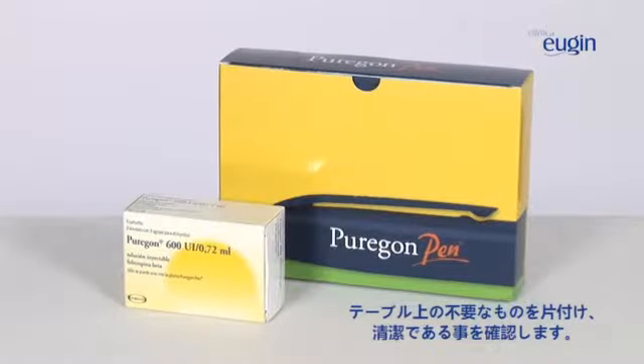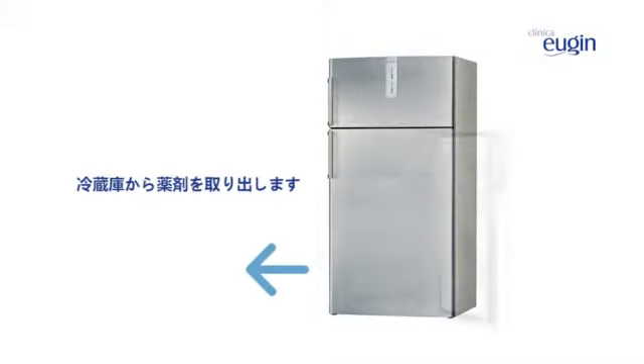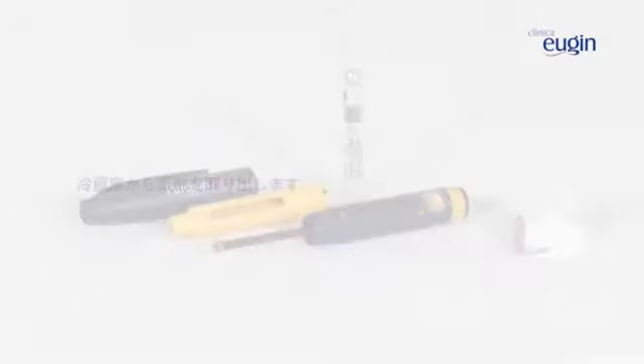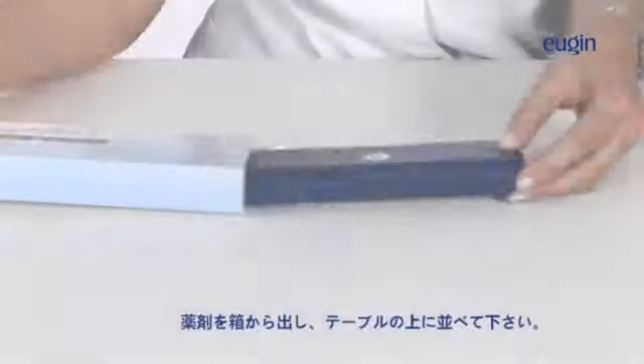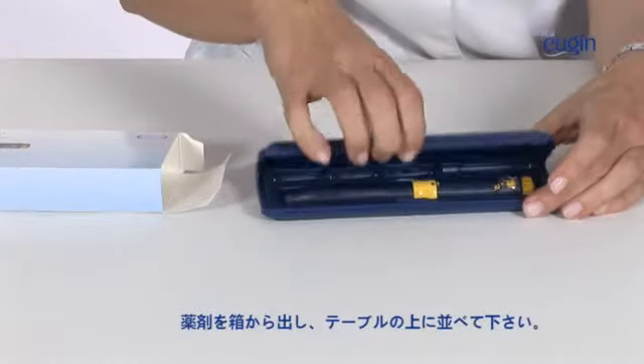Have a clean table ready. Before using the medication, you must wash your hands thoroughly. Take the medication out of the refrigerator. Open the box of medicine and place it on the table.